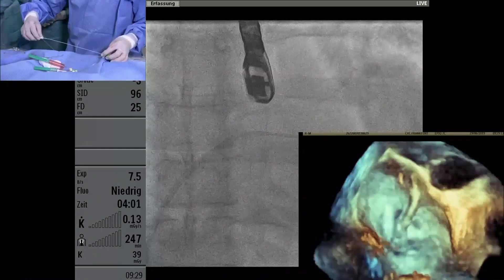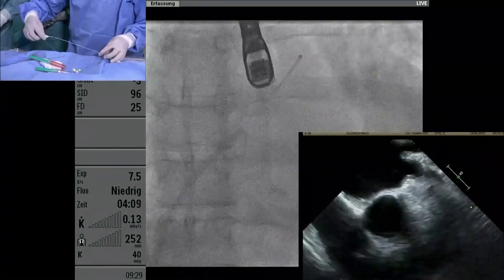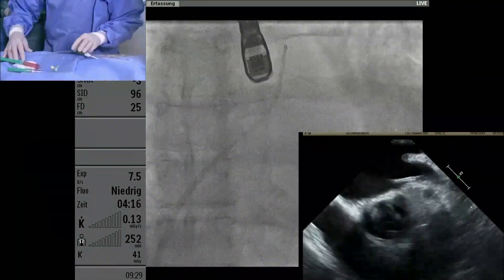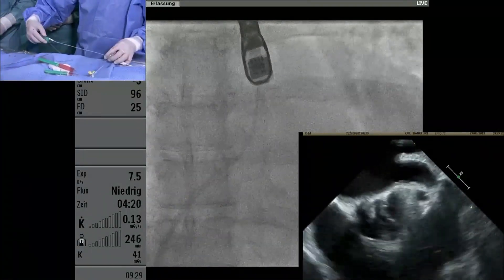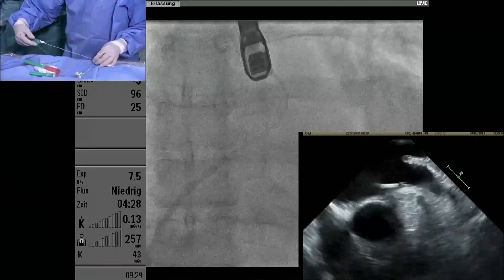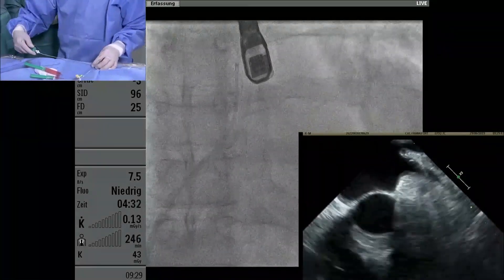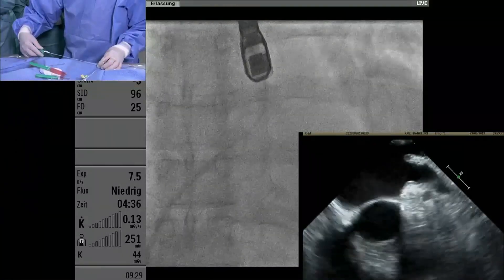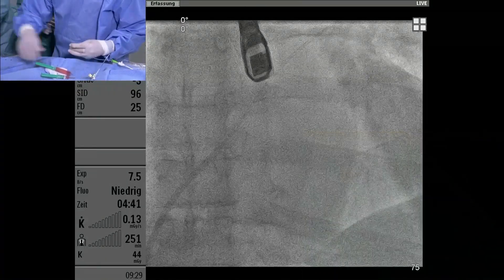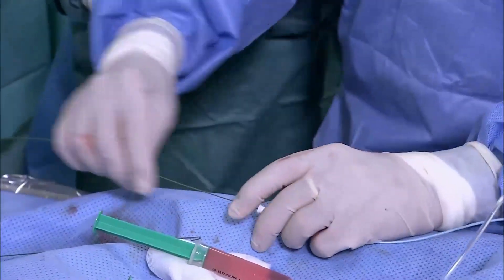Martin, is this the left atrial appendage where I am? Yes, left atrial appendage. So I go back with the sheath. Still in the left atrial appendage. Pull back. Left atrial appendage again. It's so easy to get there, we should close it. Now you're against the warfarin ridge, pointing in the right direction. Now I need the Amplatz extra stiff wire. The next step will be to use a 12-French transseptal sheath. The wire is up.